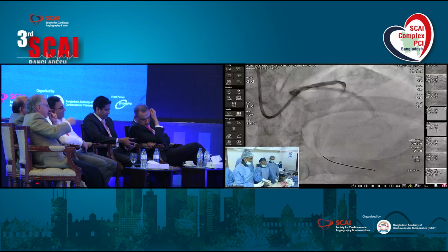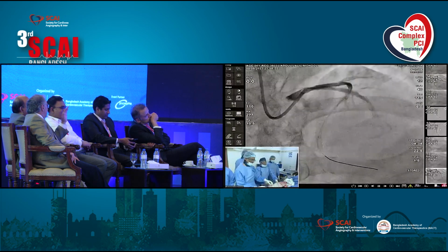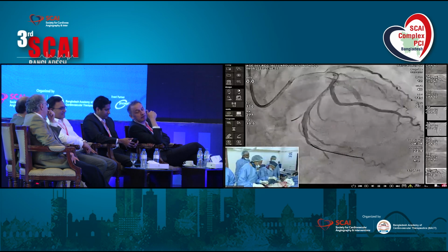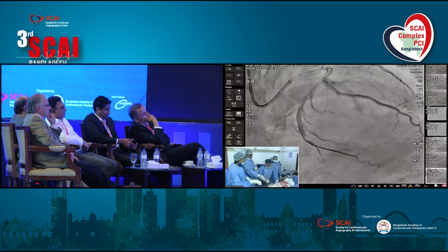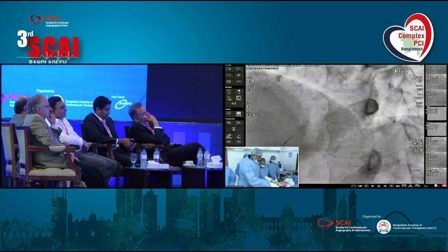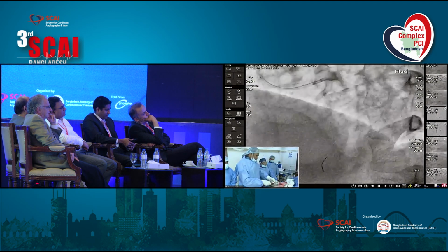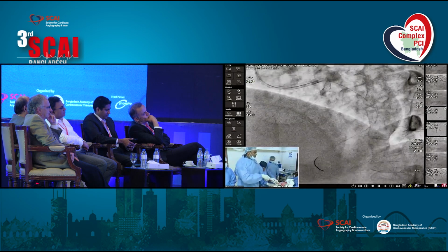So Azam will lose another 60 seconds. If Professor M.J. Azam can give us another 10 minutes, we can show. No, I think 10 minutes will not be needed, sir. The IVUS catheter is broken. So I think it is not for another. It is overdilated, I think. Angiographically, the IVUS catheter is broken, so I think we should not move forward. Last view, so you are taking LA cranial. Yes, you wanted to see another perpendicular view, so you show it.